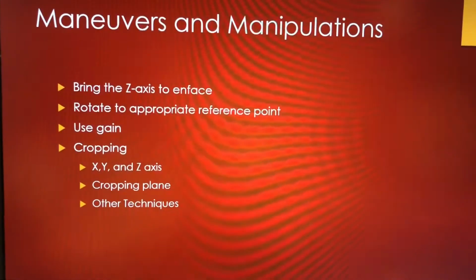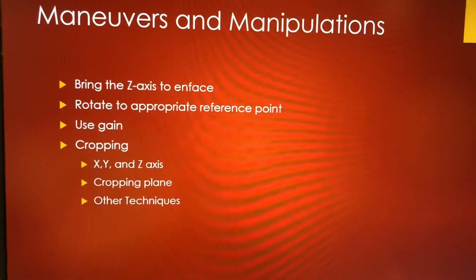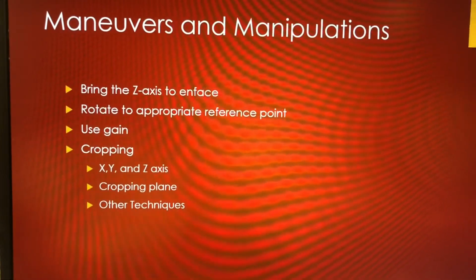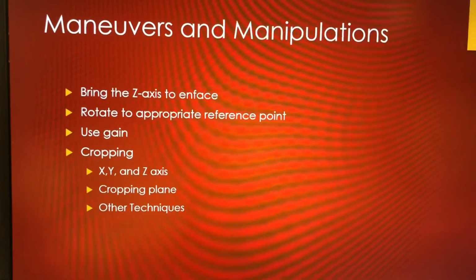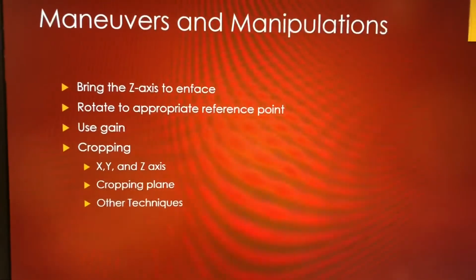So some different maneuvers and manipulations. This applies especially to the mitral valve, but we can also use the same stuff on the aortic valve, and to a degree the tricuspid valve, typically with a little bit less success.